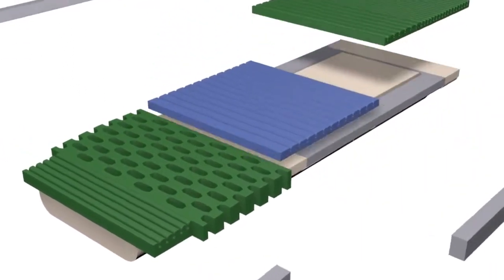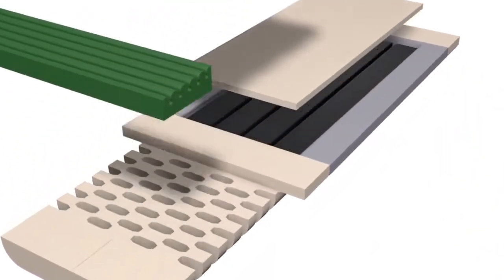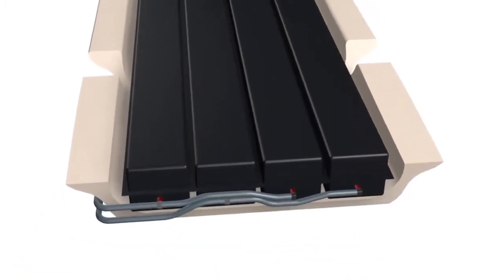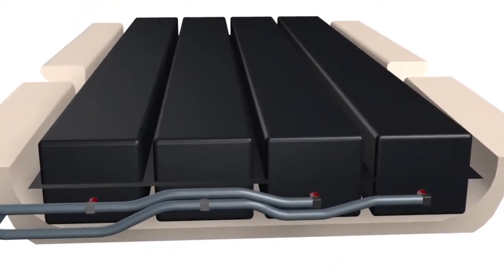Effective non-powered pressure redistribution is achieved through an outstanding combination of a zoned shear reducing engineered outer shell surrounding a reactive support chamber system.